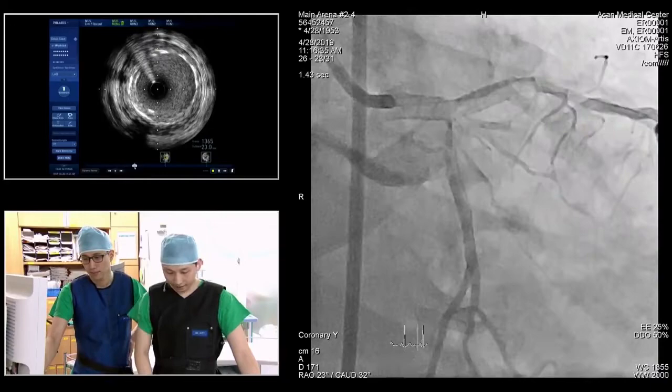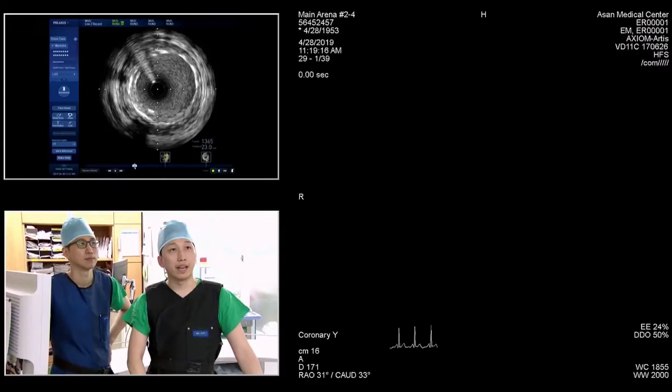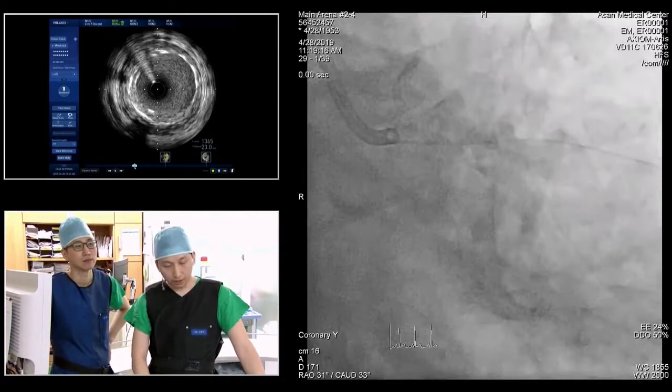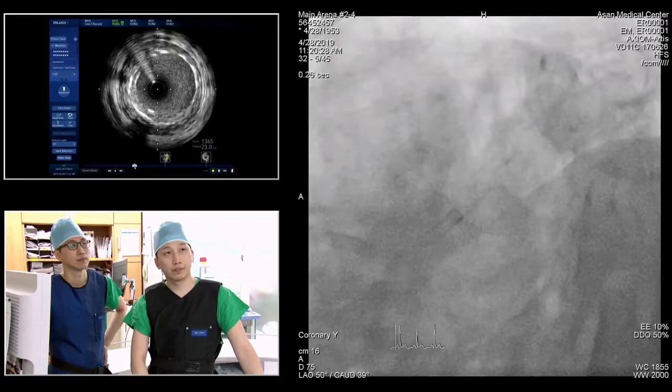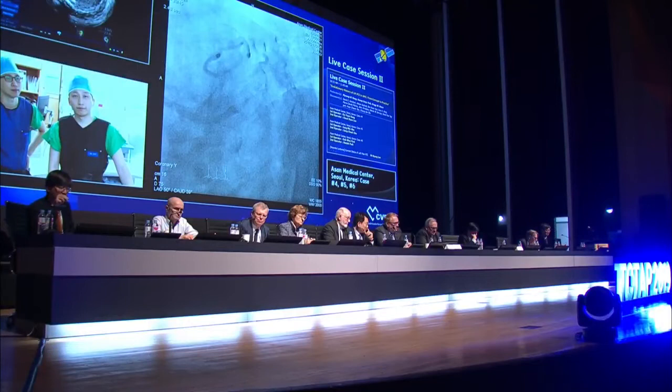Yes. After the stenting and the high pressure, the patient showed some noticeable phenomenon. The patient did not show pain or ECG change, but flow was slow. After the high pressure balloon, I finished the procedure. Excellent job. You have to be concerned about the flow compromising the intermediate branch, and you have to take care of that. Okay. Thank you for your great job. We will move to the other cath lab.